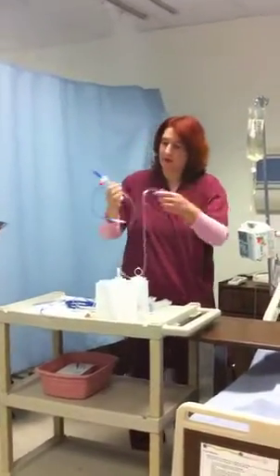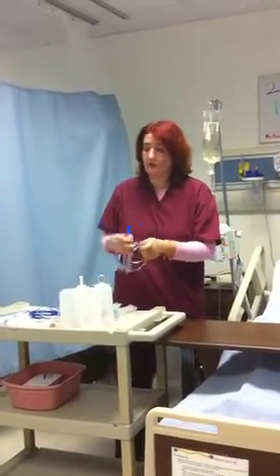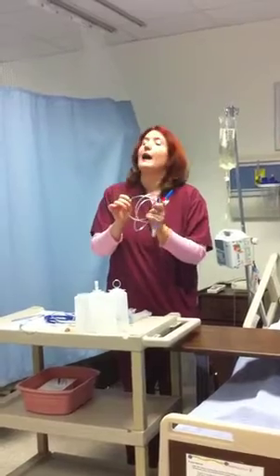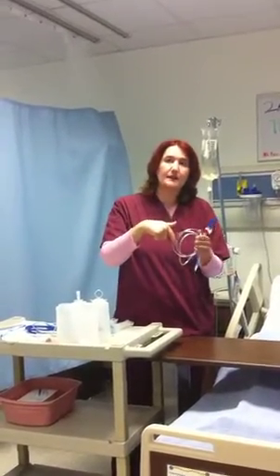And they vary in size. The smallest one is 8 French. I try to go with the smallest one that is large enough to serve as a feeding tube. The lumen is not very narrow. And also it's small enough to slide down through the nasal passage and the esophagus with least inconvenience to the patient. So it's a little bit tricky, but you need to use your nursing judgment. And sometimes you can ask the doctor. Actually, a lot of times the doctor determines what kind and what French.